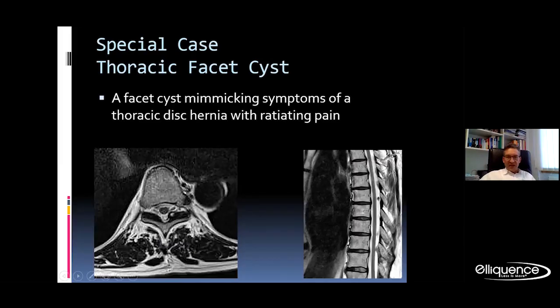Here's a very special case. Fortunately, I don't have the video to this case. These are very special situations on the thoracic spine, what can be treated even with an endoscope. Here you have to remove a lot of the lamina. The other consideration here would be an interlaminar endoscopic approach for this very, very special situation.